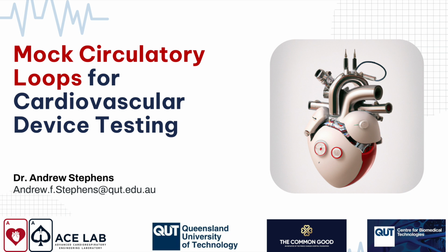Summary and final thoughts. So mock loops are a mechanical representation of the heart and cardiovascular system. Build yours based on your individual test needs and also the product that you're designing. Calibrate, validate, and recalibrate often because these things are a lot of work to maintain. Pay particular attention to validation in the areas you're measuring and, especially, around the features that you want your pump to have. Again, if you're looking at control systems, you need to know that your mock loop is responding in the right way and that it's not skewing the data that you're getting out of it.